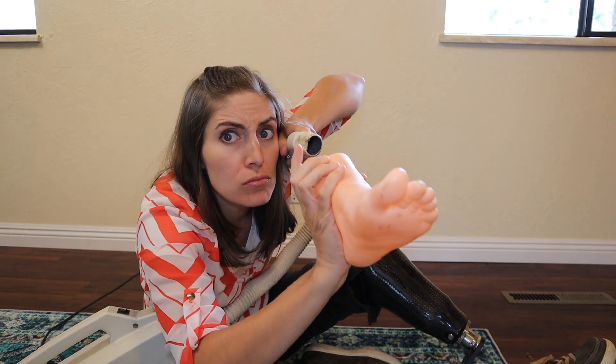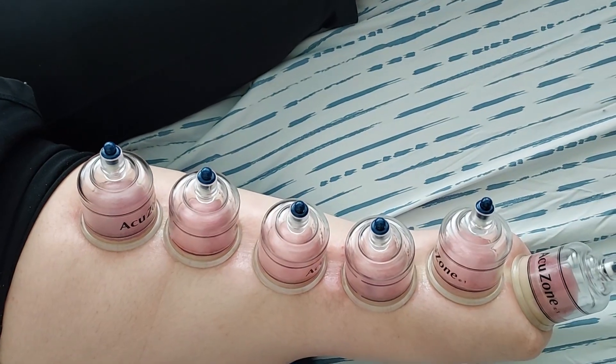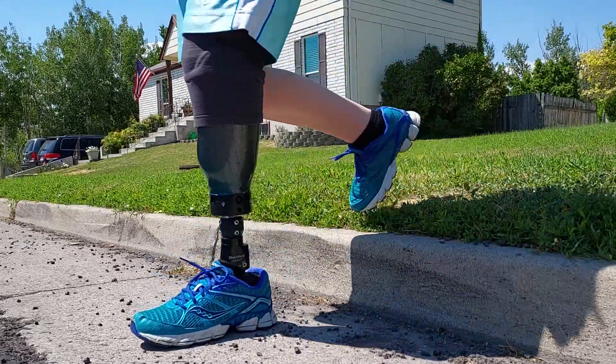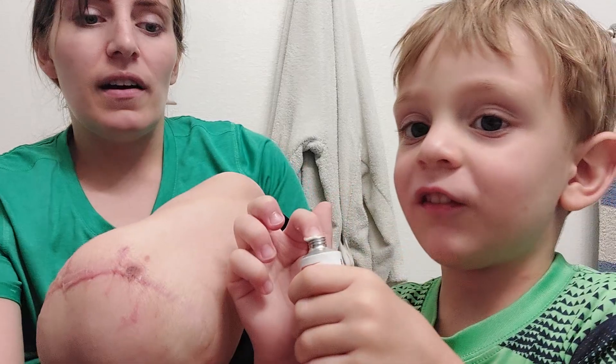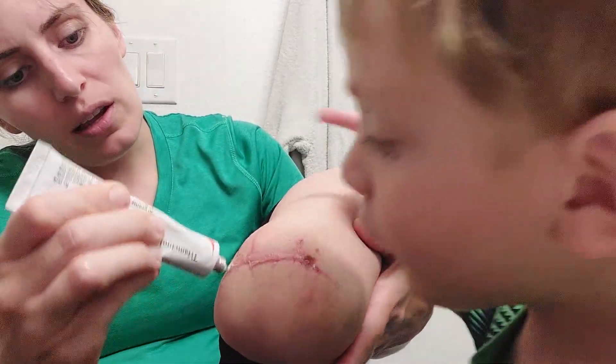If you spend any amount of time moving around with vacuums or suction, including those suction cups they torture me with in physical therapy, you'll notice that having just one part of your body taking the brunt of a vacuum for a prolonged period of time isn't fun. Most of the time it's fine, but if something goes wrong, best case scenario you'll have a very hard time explaining the weird hickey on your residual limb. Worst case scenario, you'll end up with sores or injuries. That's why we have professionals rig these things up instead of just sticking vacuums to amputated legs.